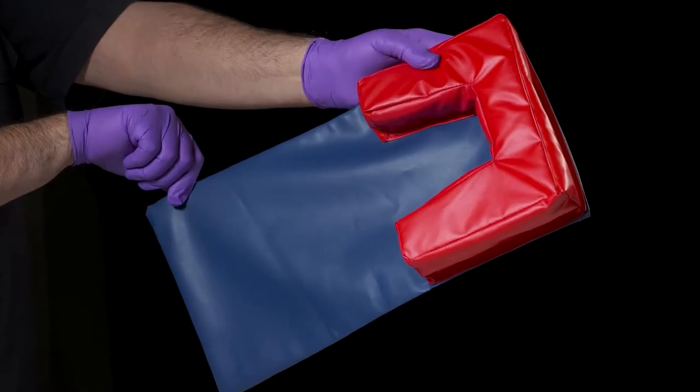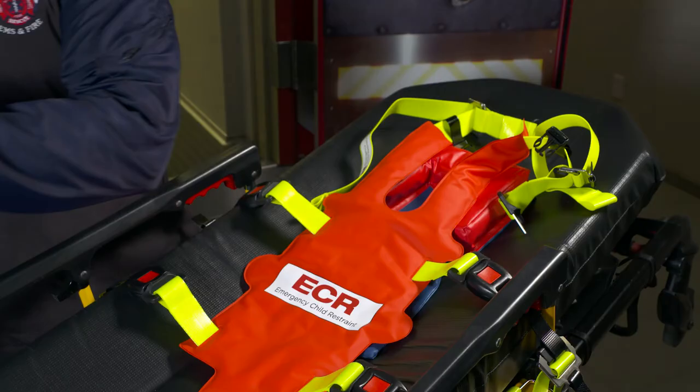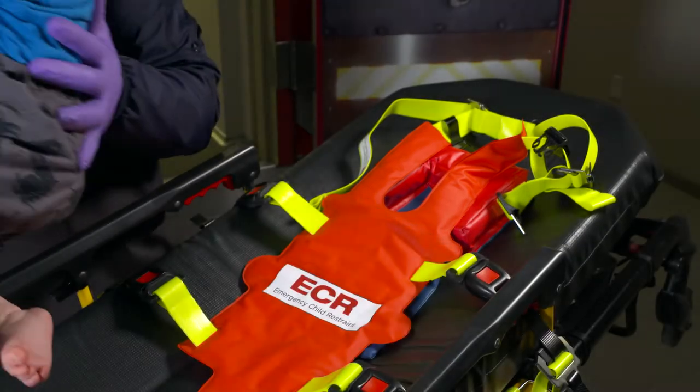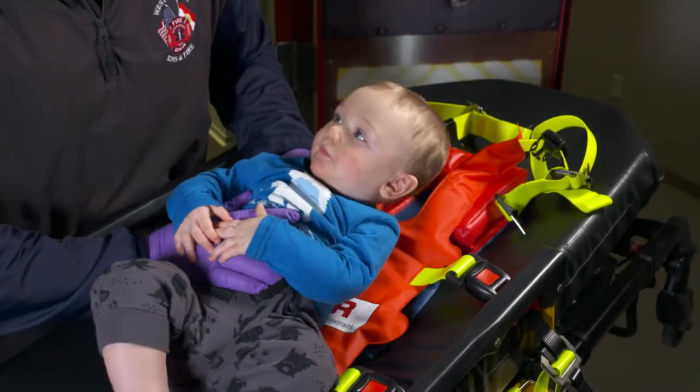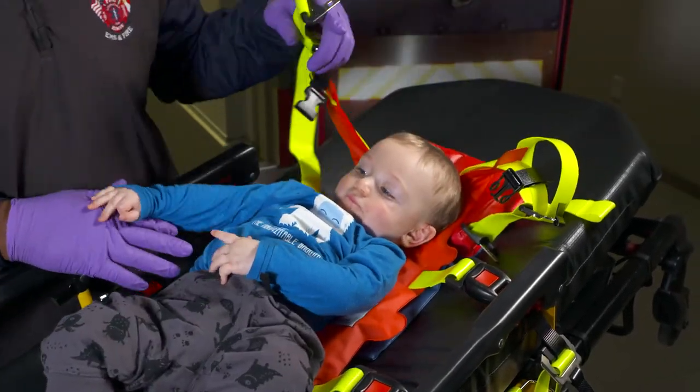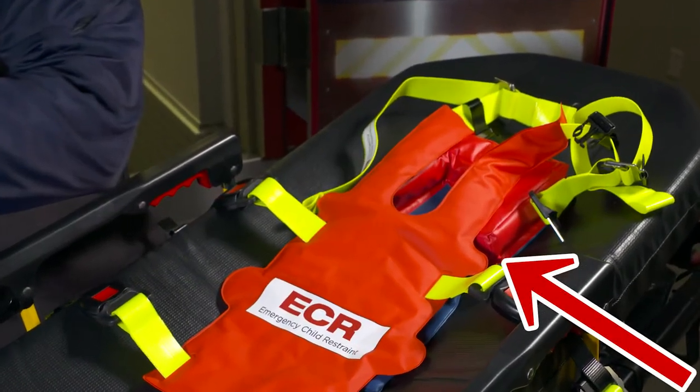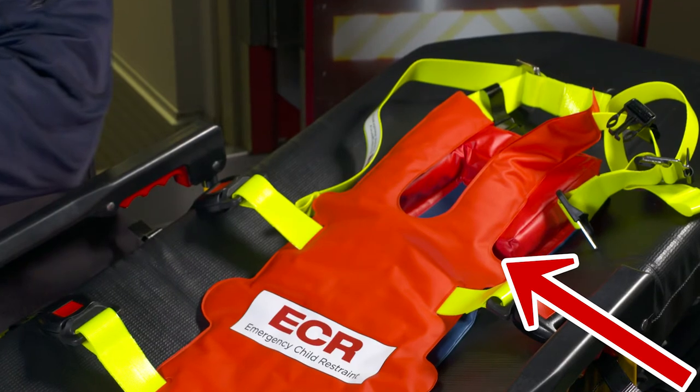The emergency child restraint system comes with a separate head support which is ideally suited for smaller patients to minimize movement and vibration. If using the head support, place it on the mattress approximately where the patient's head will be located and place the harness on top of the head support. The bottom of the harness shoulder strap should align approximately with the bottom of the head support.